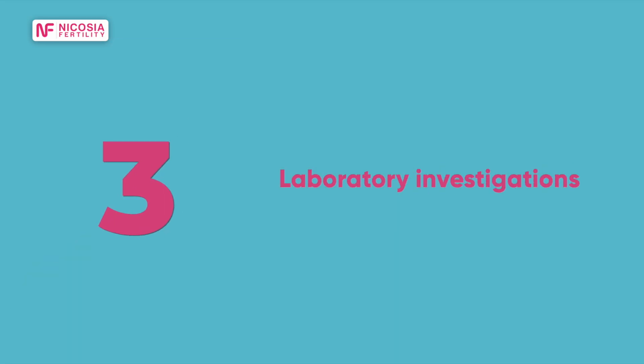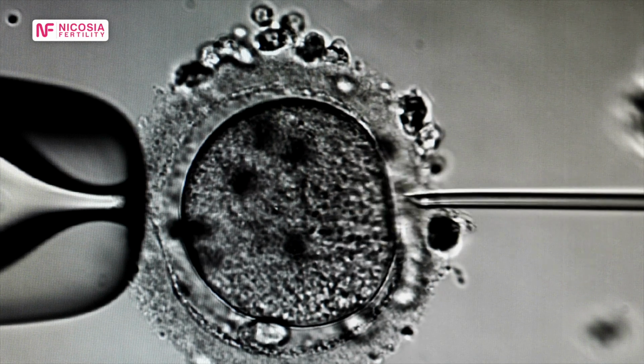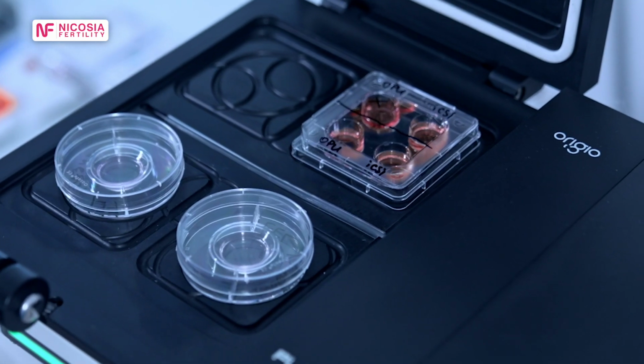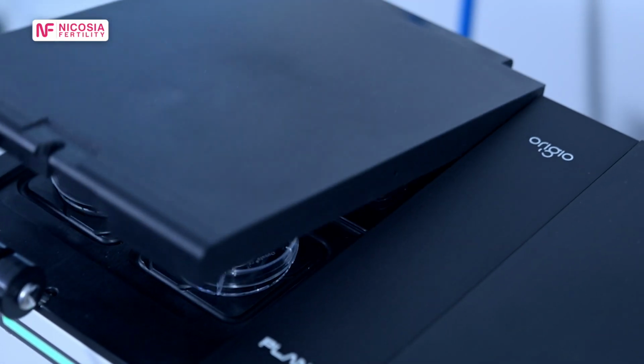Laboratory investigations. The collected eggs are then examined in the lab. Each egg is injected with a single sperm to achieve fertilization. The fertilized eggs are then placed in an incubator, creating the perfect environment for their development.